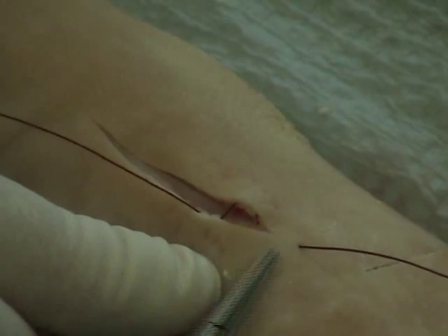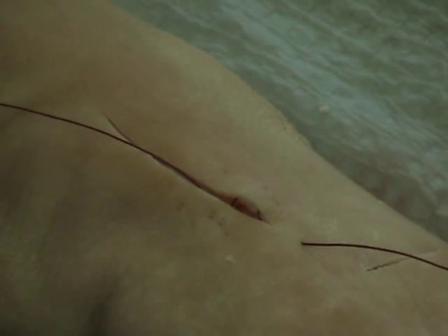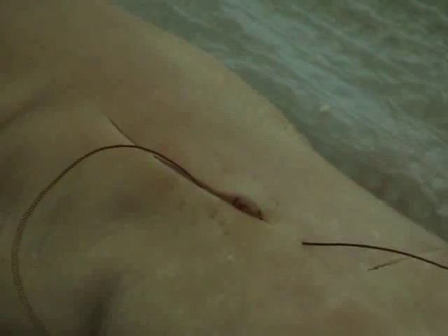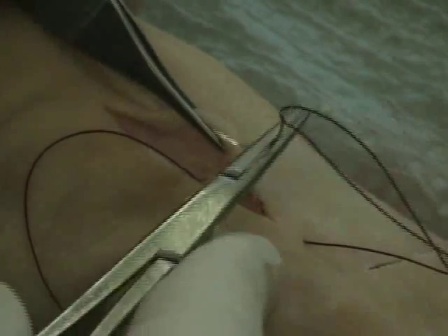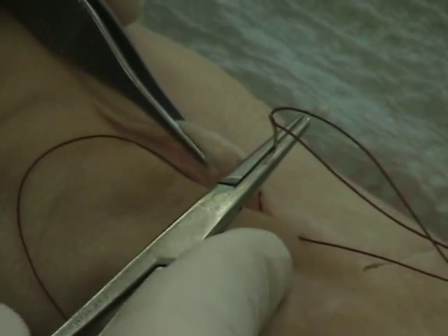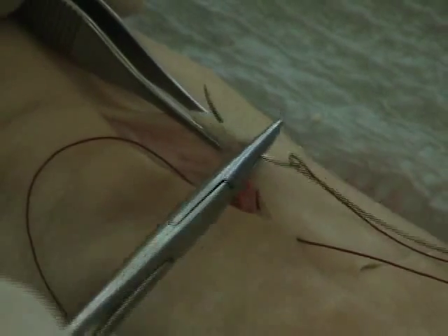In some cases you may want to go back a little bit. Notice here it looks like it's going a little bit forward, so I should have started back just a little further. I'll try to correct that for the rest, but it gives you an idea of some of the pitfalls. I pull it across to see where I want to be, pick the skin up, and back up a little bit here to make sure I'm coming through properly and out the side of the dermis.